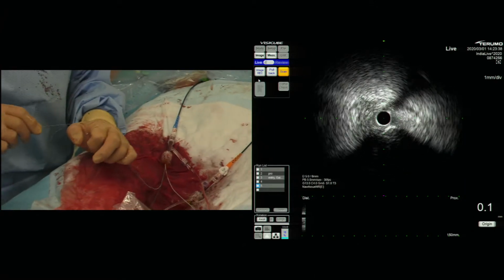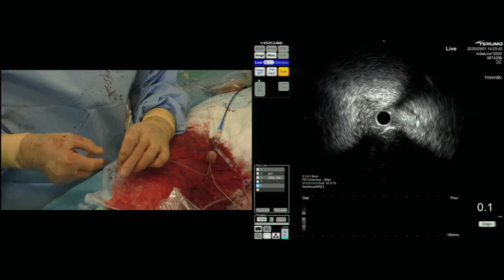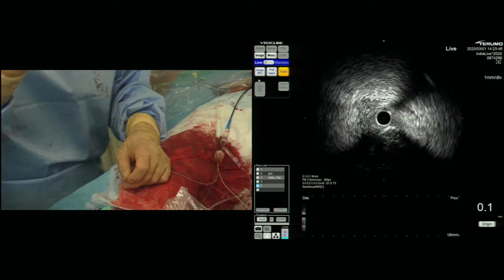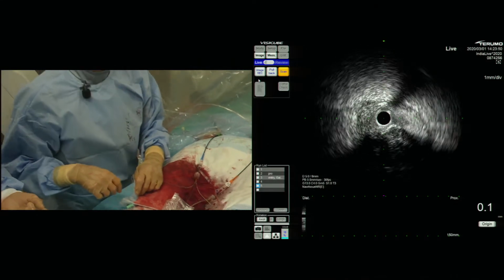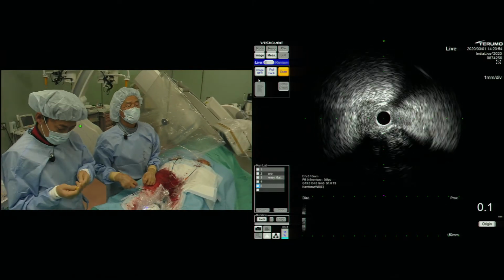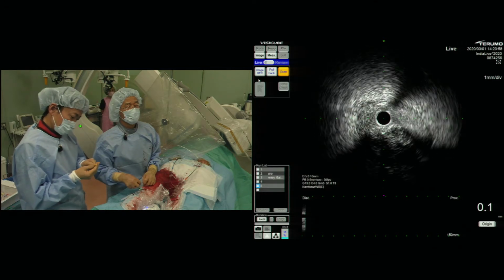So do you remove the secondary shape or you add a secondary shape? No, I just changed the angle of the first curve of the wire, because we need to change the route just after the tip of the Corsair.